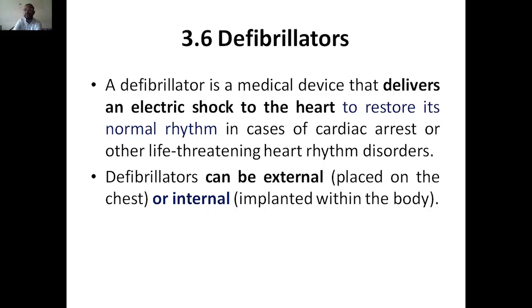For that we deliver an electric shock to the heart, so that it restores its normal rhythm or normal beating process. Defibrillators can be external, that means from outside the body, or internal also. Most probably it will be placed on the chest, so external, whereas in some cases it is implanted within the body.